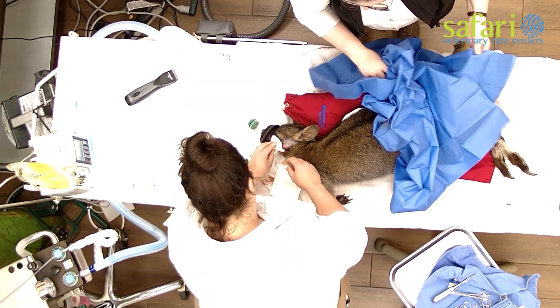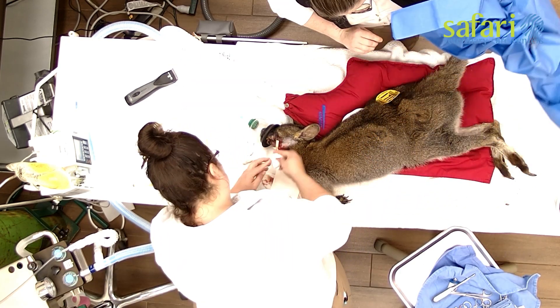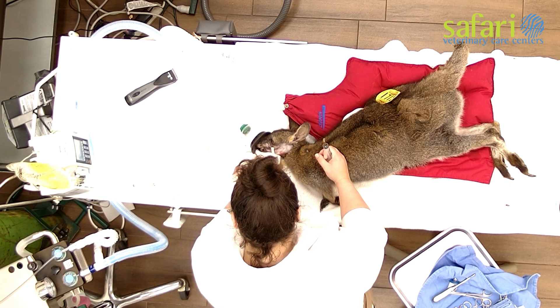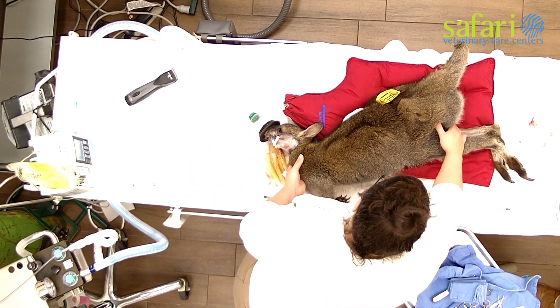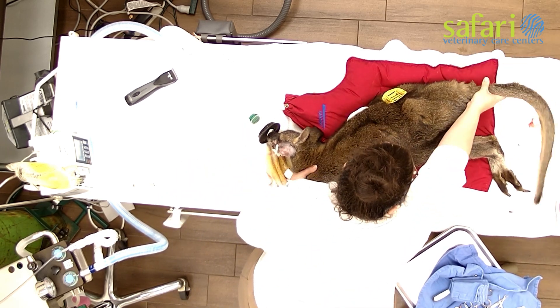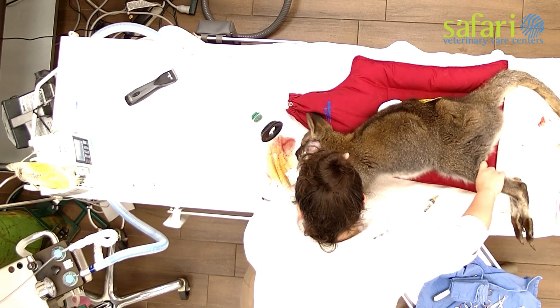The drain tube, made of latex rubber, is placed both above and below the infected site, ensuring thorough flushing of disease material from the area. After surgery, the wallaby will recover from anesthesia and be sent home.